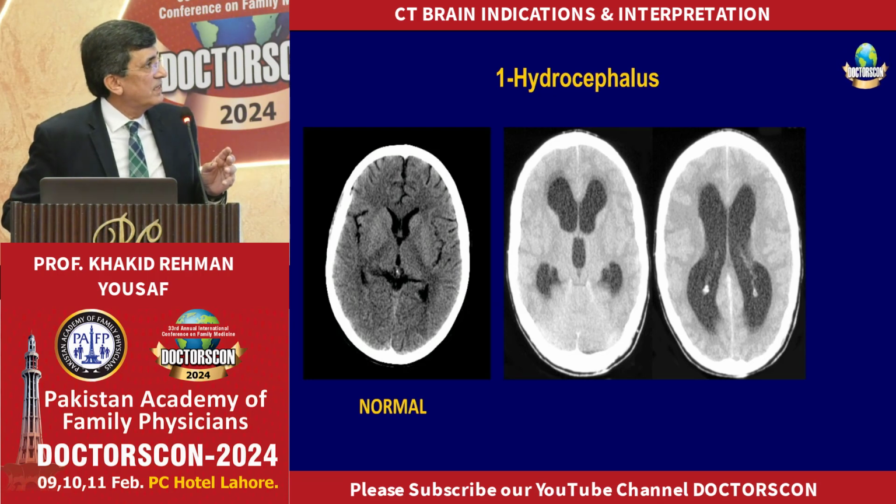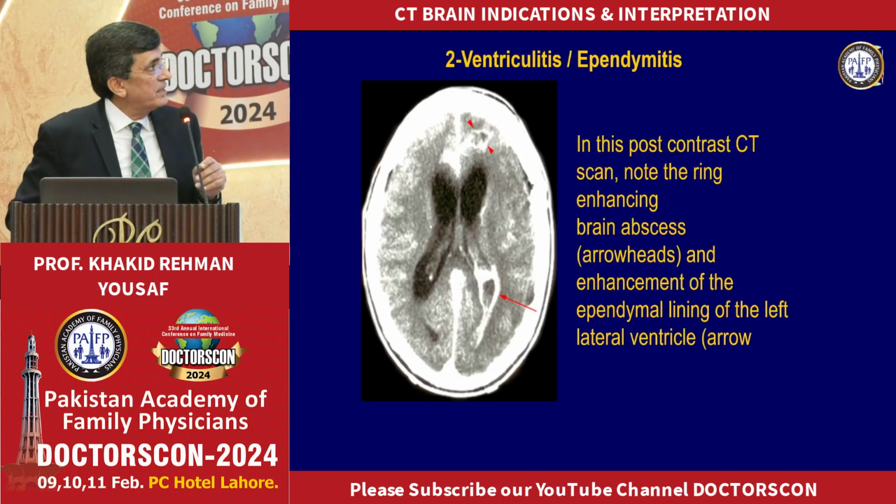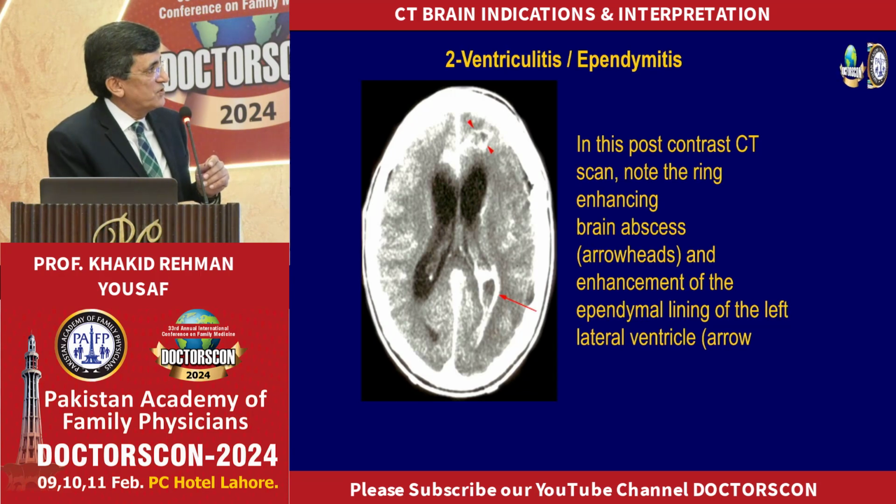This is normal lateral ventricle configuration, but due to outflow obstruction due to infection, the ventricles are dilated, and this is a case of ventriculitis, enhancing.